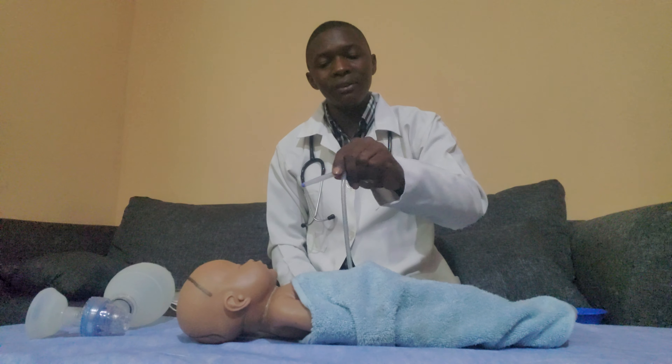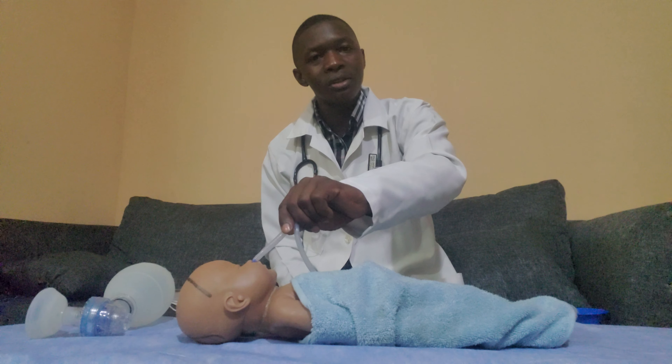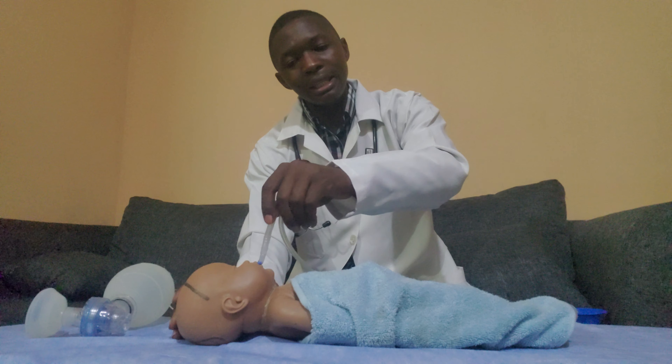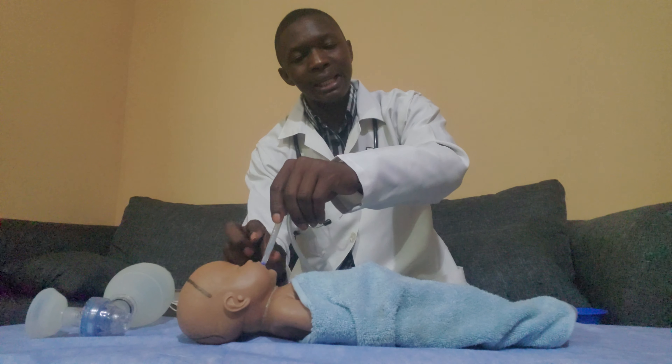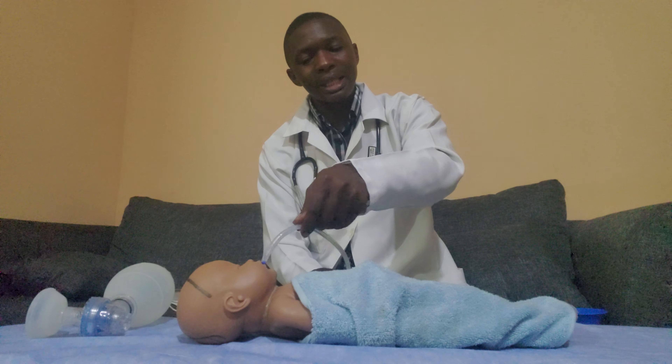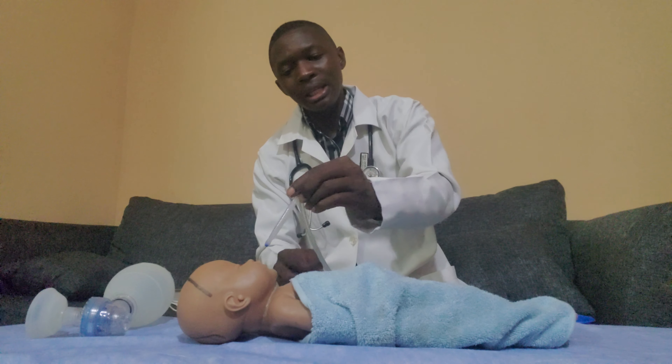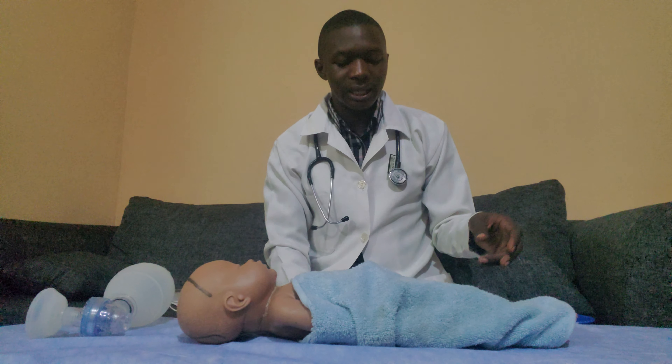You need to clamp the tube. If there are secretions in the nostrils, insert it and suction, then do the other side. In adults, you will often need to go through the mouth all the way to the airway because suctioning may need to be deeper. Clamp the tube, place it, insert into the airway, then let go and the machine suctions. Re-insert some fluid to clear the tube, clamp again, and suction until the airway is clear.